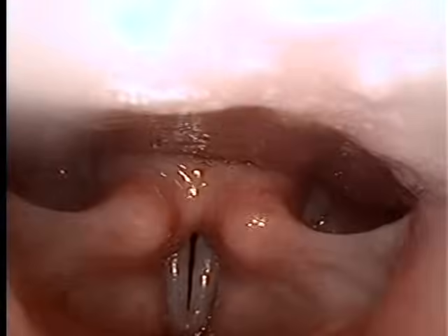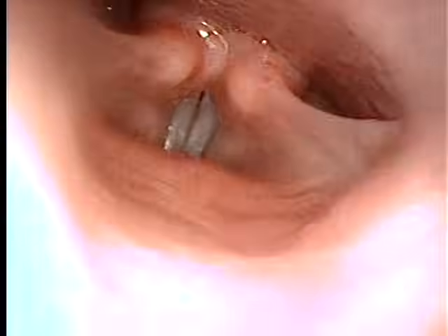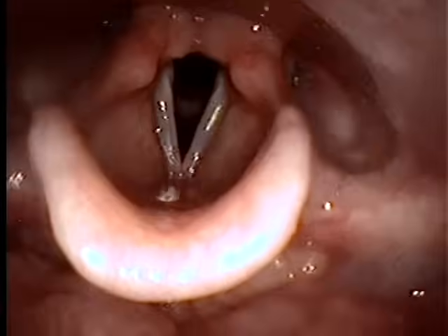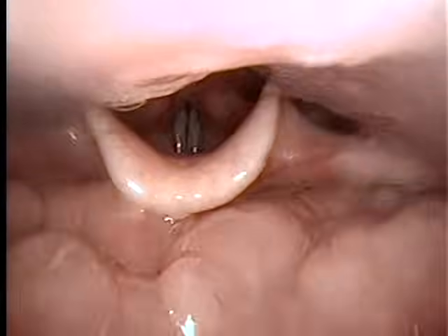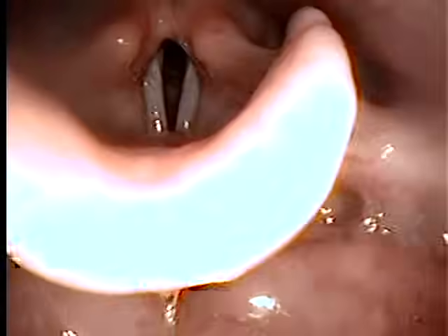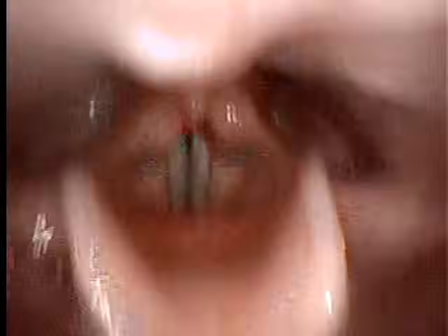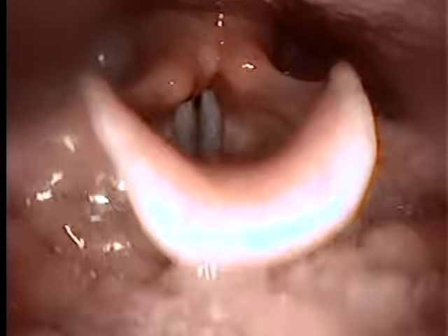They're much more like this than fluttery. You see the false vocal cords on each side of your true vocal cords? They really participated more during the belt. Interesting. This is classical — Hey, Mr. Arnstein, here I am. And then this is mixed — Hey, Mr. Arnstein, here I am.